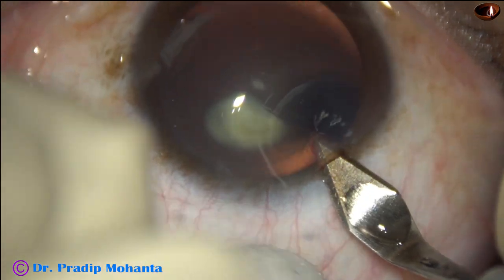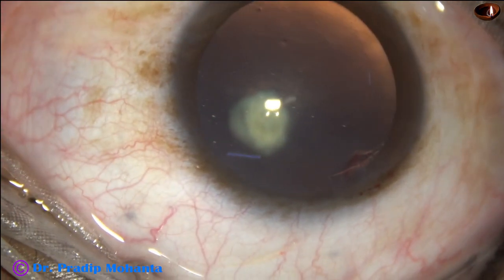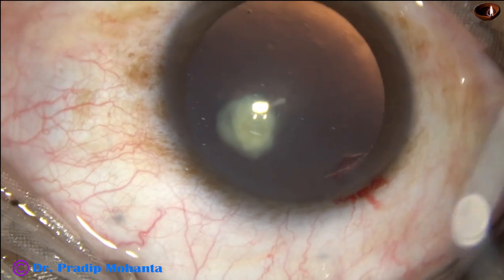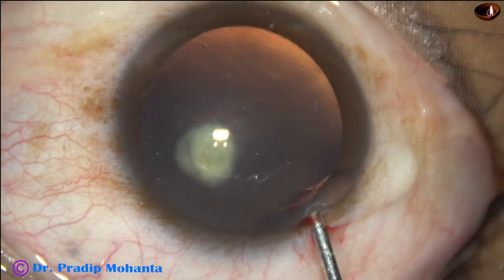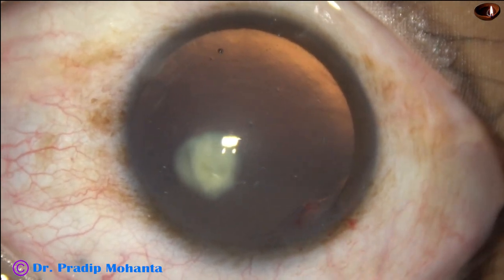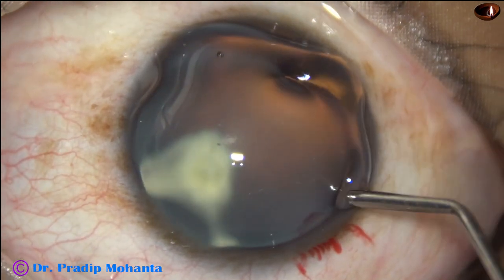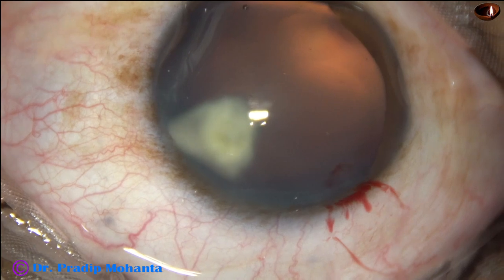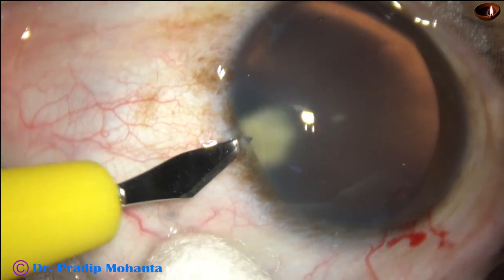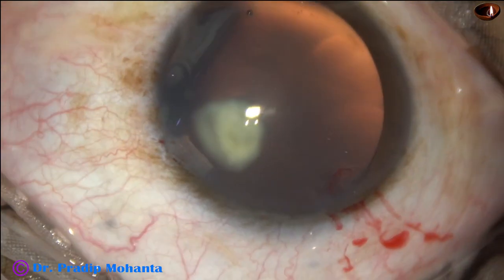This is the main incision with a 2.8 millimeter steel keratome. The anterior chamber is filled up with 2% hydroxypropyl methyl cellulose. Methyl cellulose is applied over the cornea for better visibility. A side port is made on the left side of the main incision, about 3 clock hours away.